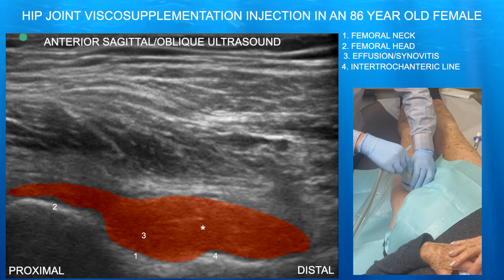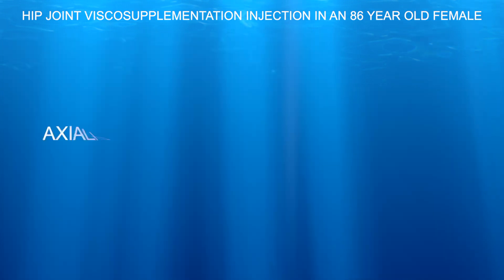Here we're going a little bit distally. We can see this fairly sizable effusion. What's interesting, it seems to bulge past that intertrochanteric line where you would not expect it to go that far.